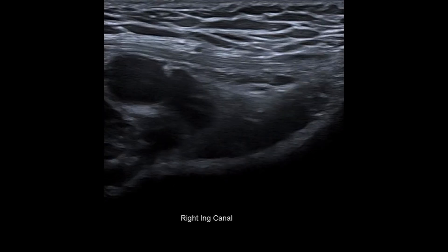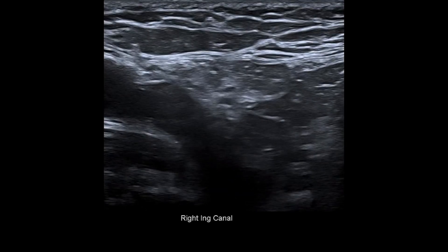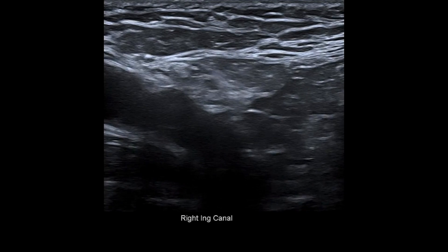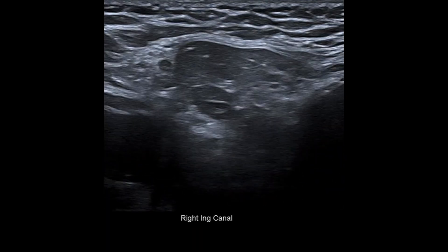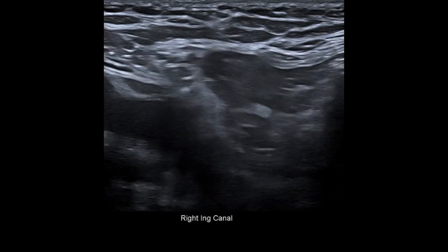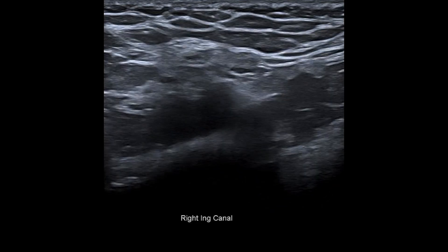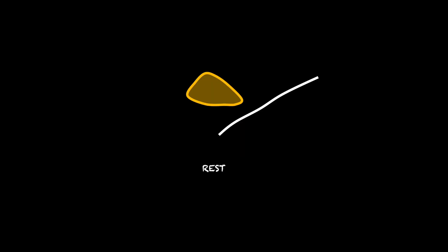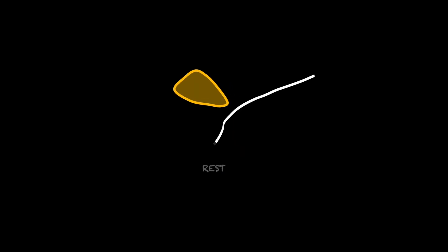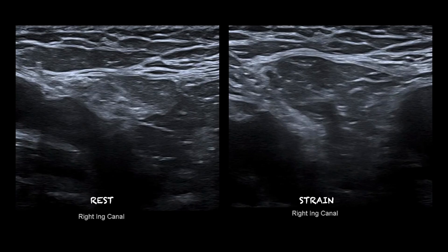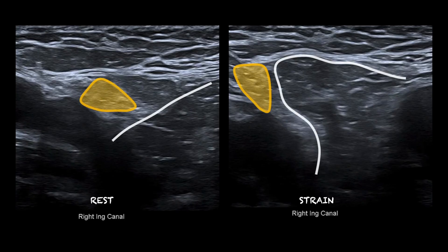In this example, we see with straining there is excessive movement medial to the inguinal canal, causing some displacement and rotation of the canal, but nothing is pushing through the canal. There is no fascial defect, and therefore no inguinal hernia. This is posterior wall laxity, which in the young and athletic population is often termed a sportsman's hernia.